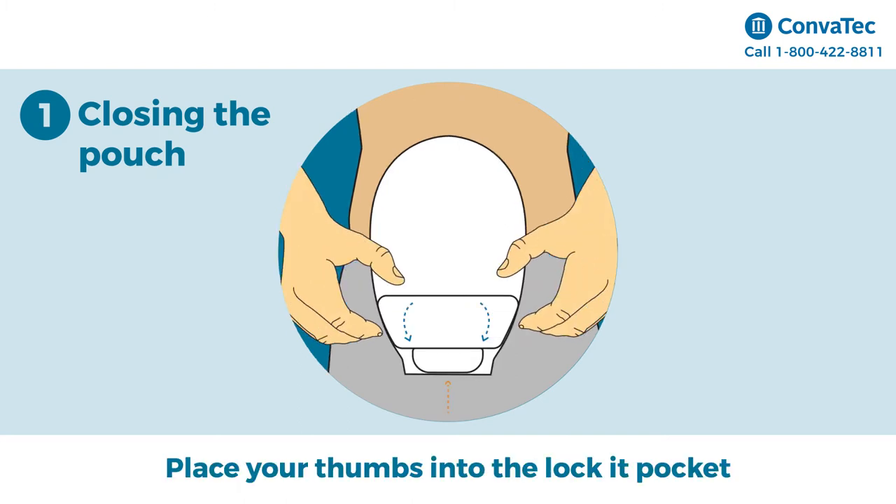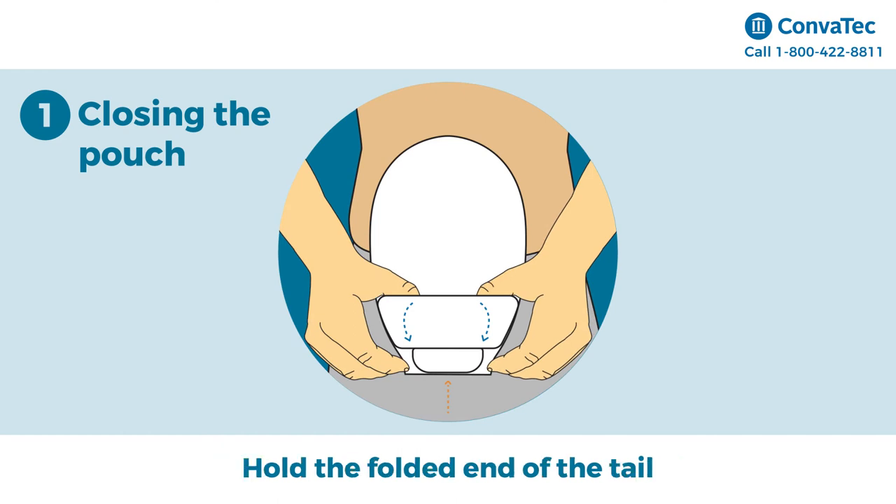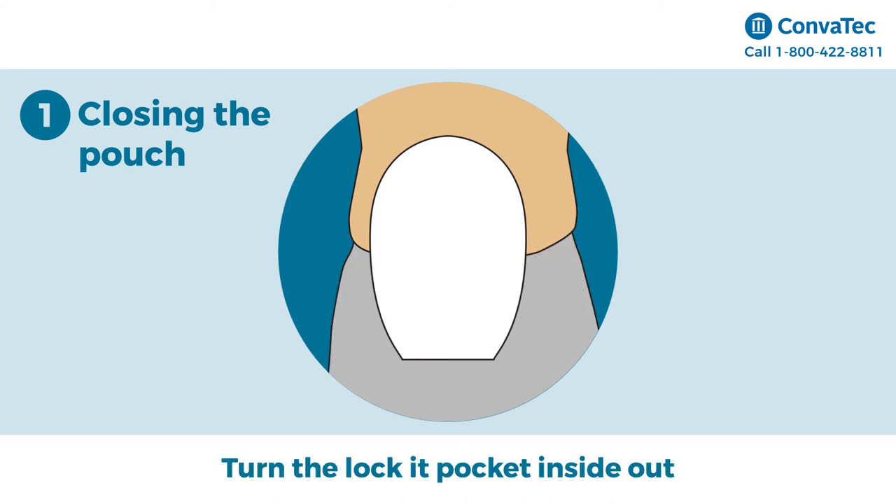Place your thumbs into the locket pocket and hold the folded end of the tail between your thumbs and your index fingers. Turn the locket pocket inside out to hide the tail inside the pocket.